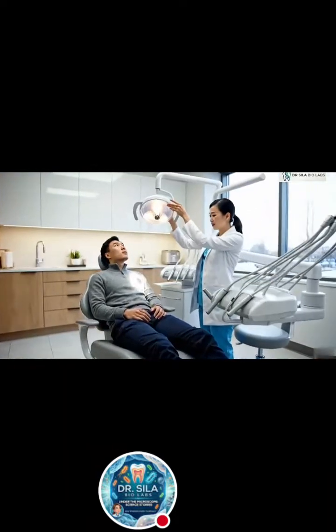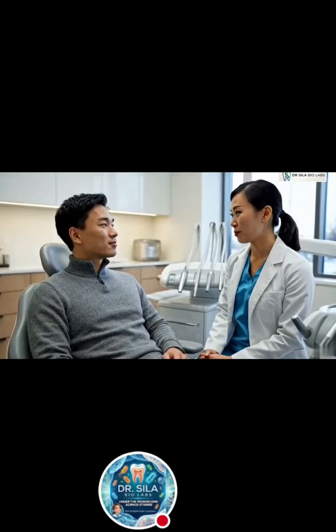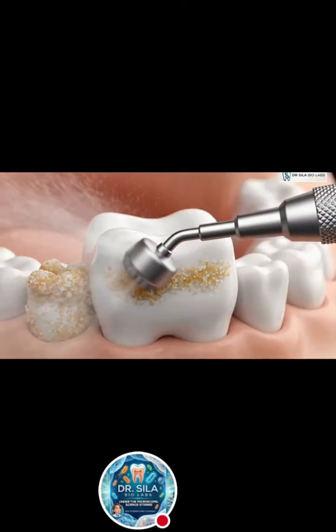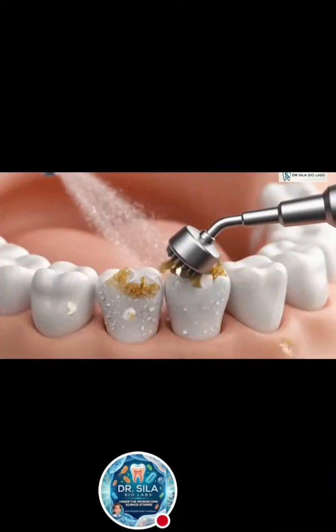Many patients wonder what scaling actually feels like during treatment. For most people, scaling is a safe and well-tolerated procedure. The most noticeable sensation is often the vibration produced by the ultrasonic scaler. Patients may feel a gentle buzzing sensation against the teeth. Many patients also notice a high-pitched sound created by the instrument.